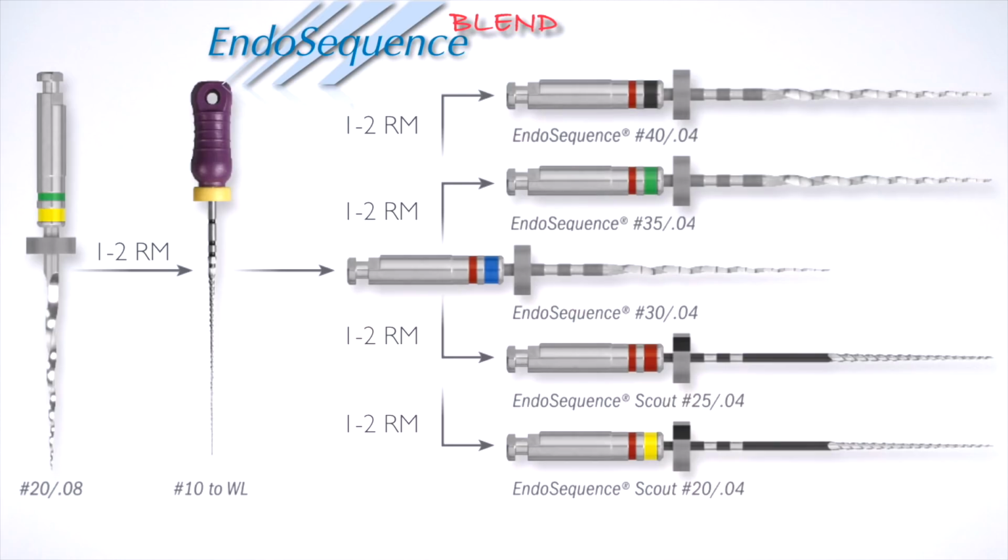So what I wanted to do in this little video is to share with you how I use the EndoRing 2 as an organizational tool to implement this protocol of EndoSequence blend using the austenitic and martensitic files.